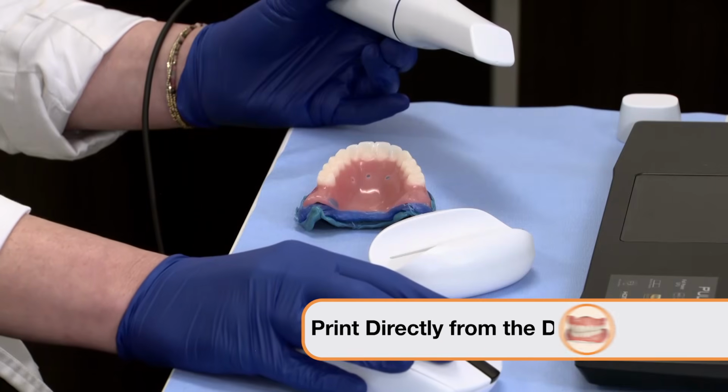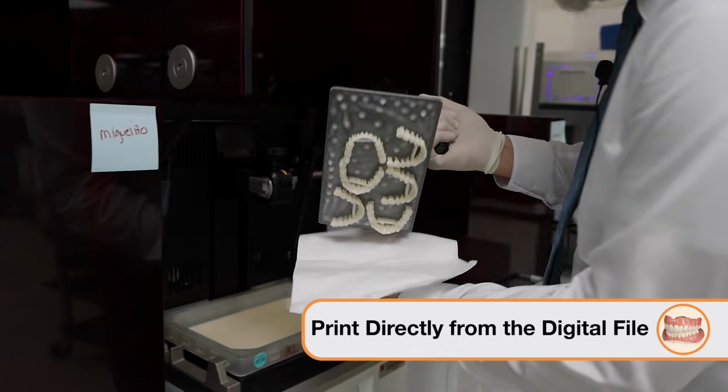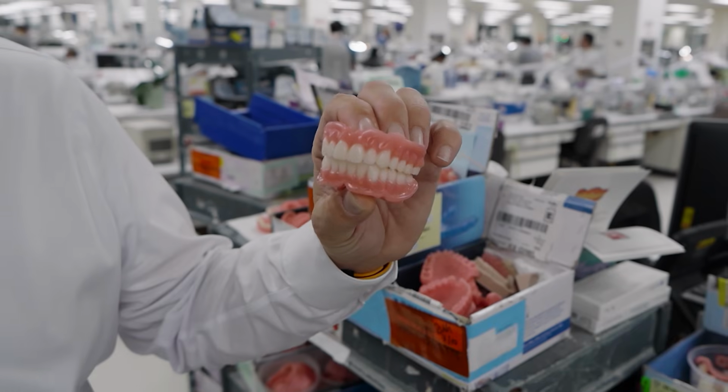Second example that I can think of is, let's say someone that you made a denture using the digital workflow a year ago. And Mrs. Jones calls you and says, hey, I can't find my denture, or my dog ate my denture, or it's broken in half. Normally, that patient will come back in and go through the 4 or 5 visits of creating the brand new denture starting from fresh, from the beginning, right? But if you have the digital file, all you need to do is call the lab and say, hey, remember Mrs. Jones? Print me another denture, send it to me, and within a couple of days you'll get it, and you'll just have to deliver that to the patient.